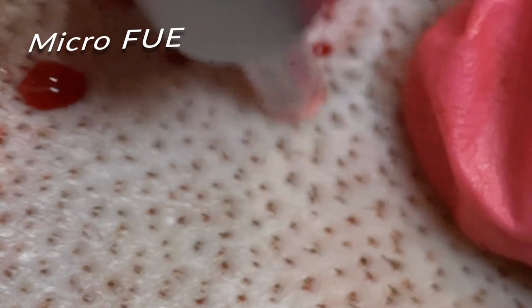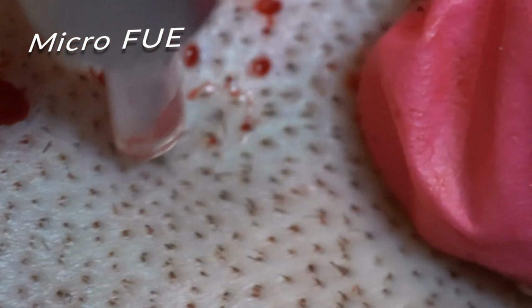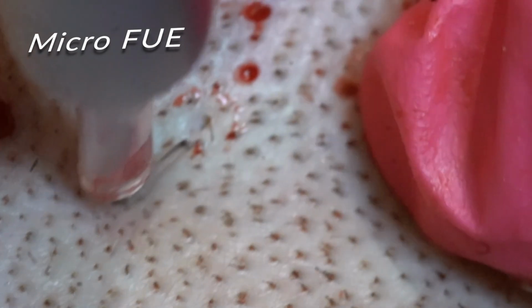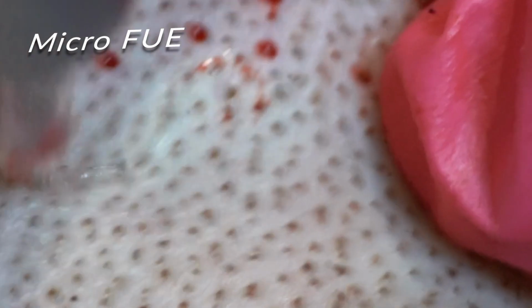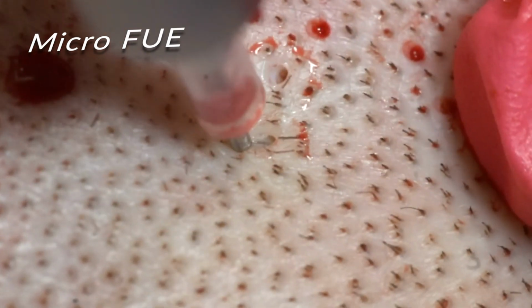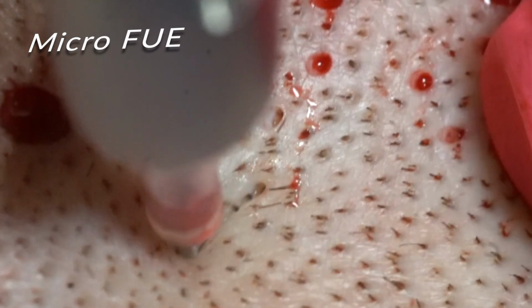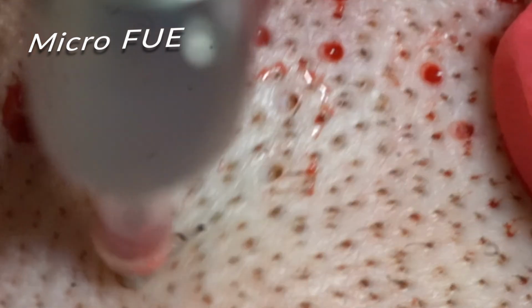Now we see micro FUE. You're going to see a quick rotation and vibration, but the suction is actually going to pull his hair out, and there we go. We see a nice follicle with great tissue around it. Very easy, almost like smooth like butter. We're doing it again, vibration, suction, and we're going to see these grafts come out perfectly. That's 2 out of 2.